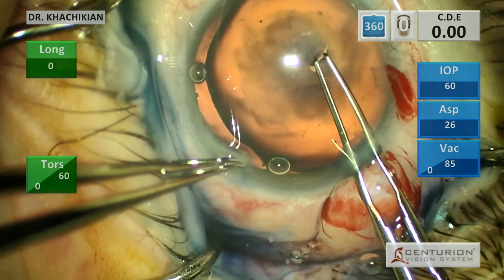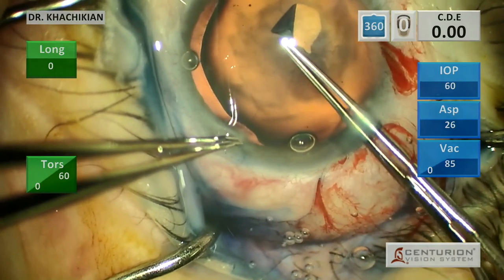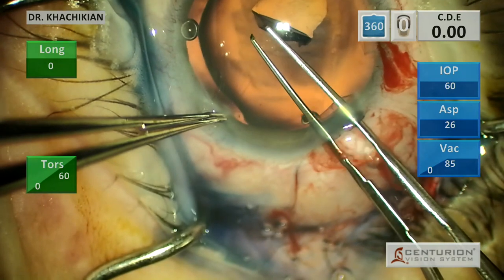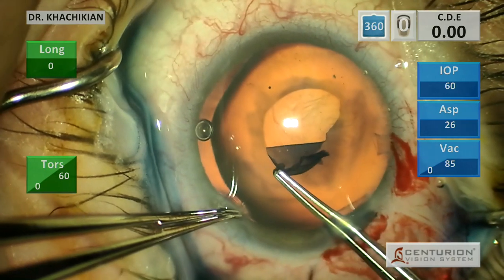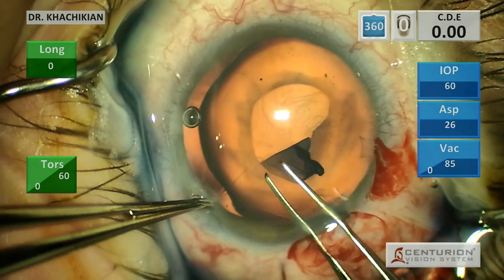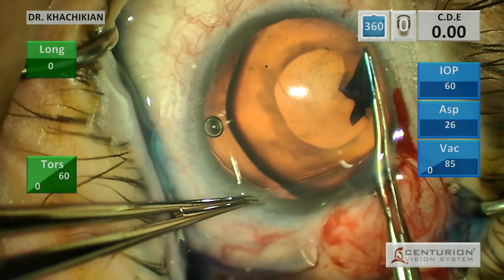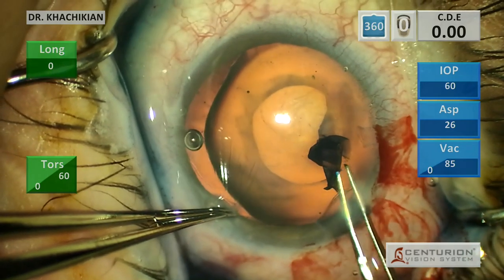There's a little weakness there, but it looks like I'm going to be able to make my anterior capsular rexis pretty easily. We want to shift it slightly inferiorly because what we're going to do eventually is put in a capsular tension ring, possibly a capsular tension segment, and that's going to shift our opening of our capsular rexis superiorly as we do that. So we're going to make this capsular rexis slightly inferior and probably slightly smaller than average, because I want to have a good purchase for the capsular hooks that I put in.